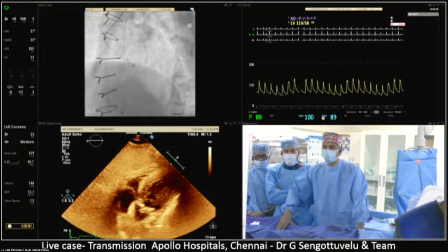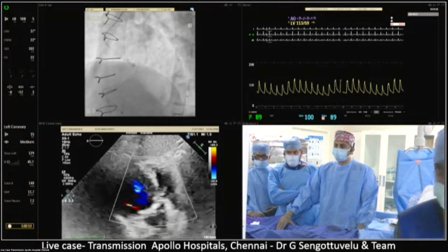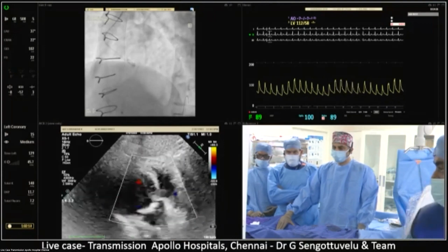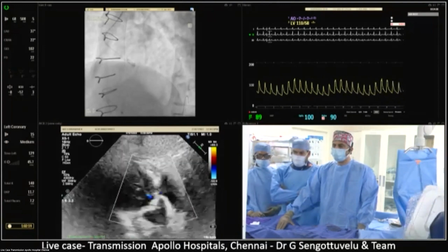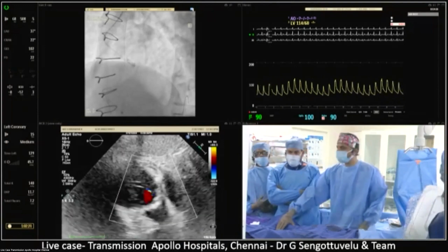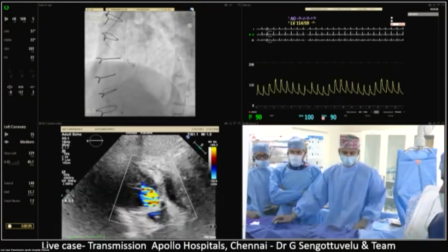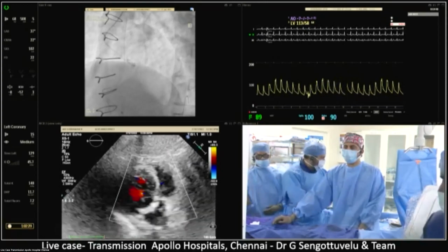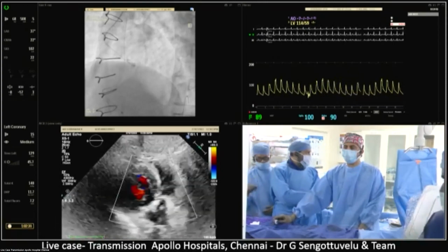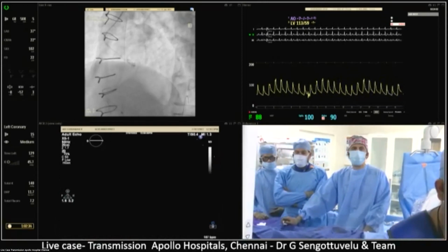So the one consideration would be what Sushil pointed out, that you'd probably be with a 23 balloon expandable valve here versus a 29 SAPIEN. It's a young patient, so it's important to consider what their functional capacity is, how active they are, and how much residual gradient you would get. With these 23 balloon expandables, our experience is that 30 days out, 3 months out, their gradients always tend to be higher than what you left them with.